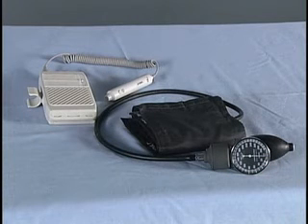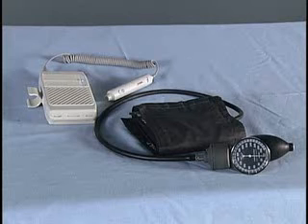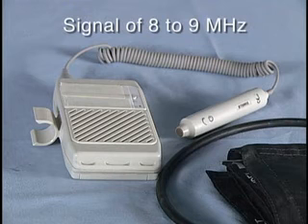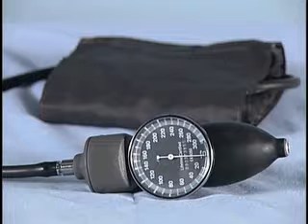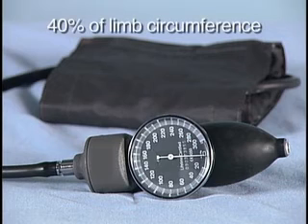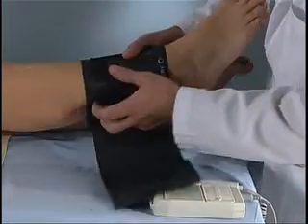In order to measure the Ankle-Brachial index, you will need the following equipment: a continuous wave Doppler device, ultrasonic gel, and a sphygmomanometer with a blood pressure cuff. The Doppler ultrasound probe should produce a signal of 8 to 9 MHz in order to examine peripheral blood vessels. Handheld Doppler devices are generally adequate to measure the Ankle-Brachial index. The diameter of the inner bladder of the blood pressure cuff should be 40% of the limb circumference. The examination should be performed with the patient supine and in a warm and comfortable environment.